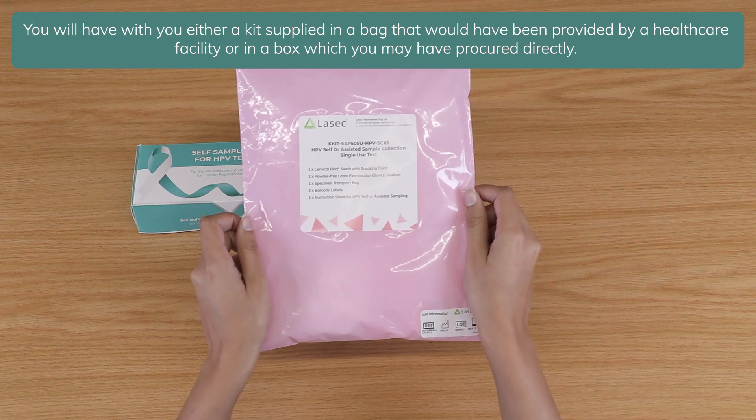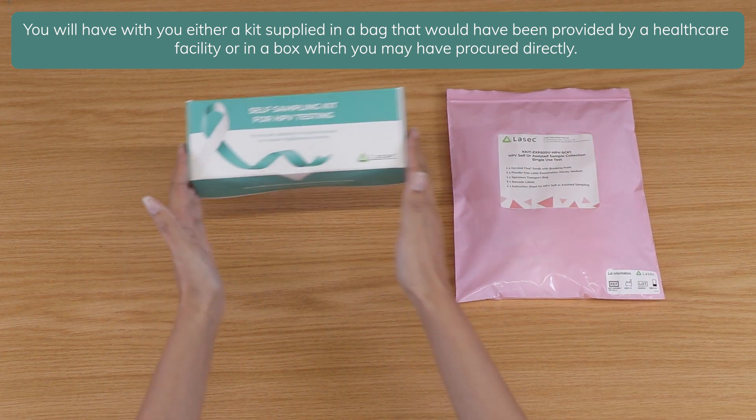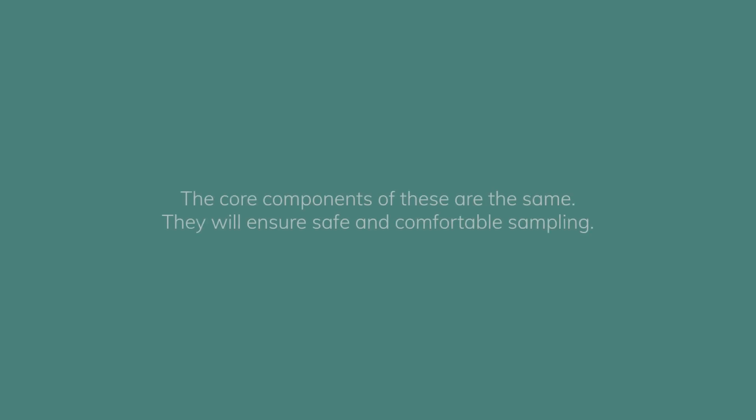You will have with you either a kit supplied in a bag that would have been provided by a healthcare facility, or in a box which you may have procured directly. The core components of these are the same and will ensure safe and comfortable sampling.